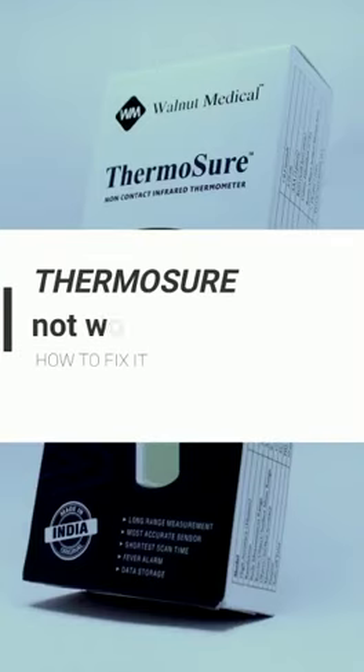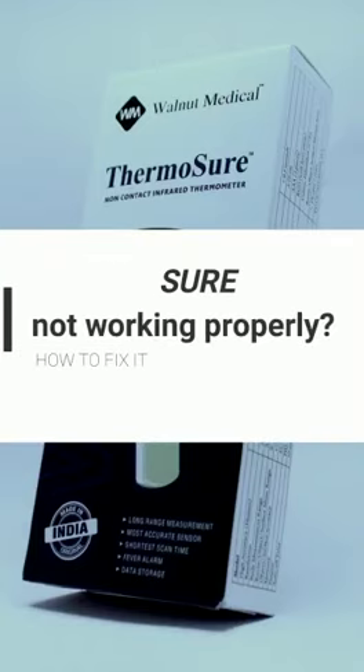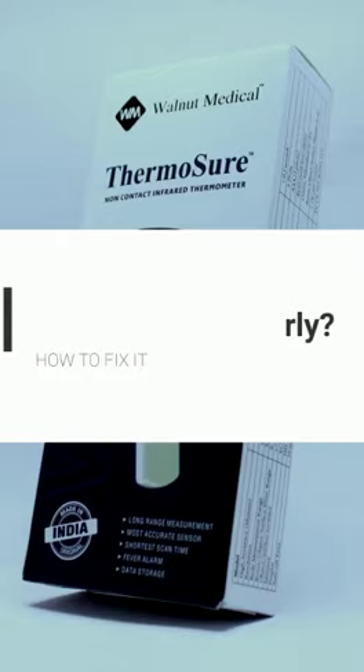Is your ThermoSure thermometer not working properly? Here are some common issues and how to fix it.